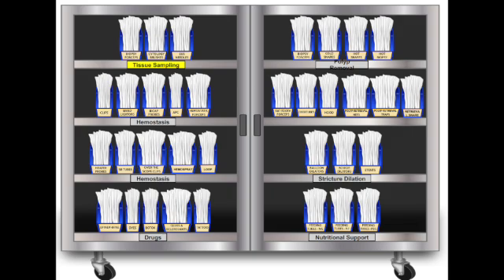Feeding tubes first, quick overview. Nasogastric tube, NG tube, short-term feeding, common on hospital wards, goes through the nose to the stomach. Right. Jejunal tube, J-tube, also usually short-term, placed endoscopically over a wire past the stomach into the jejunum, used when the stomach isn't emptying properly. Okay. And long term? That's the PEG tube, percutaneous endoscopic gastrostomy, or G-tube, placed endoscopically through the abdominal wall directly into the stomach for long-term feeding.